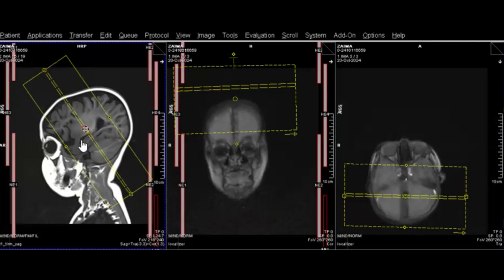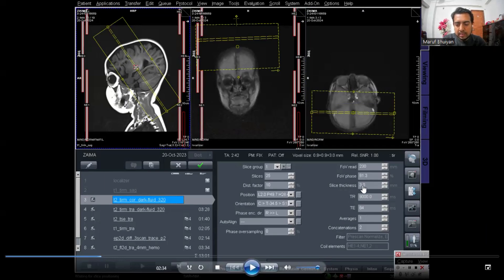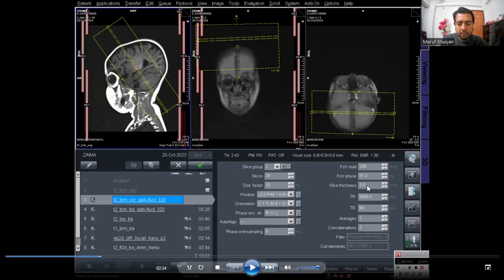The whole ventricle with the hippocampus should be covered. The key point is that the slice thickness is 3mm for the epilepsy protocol. You can keep 25 slices or increase as needed. The coronal planning must be perpendicular to the hippocampus — this is the most important thing.